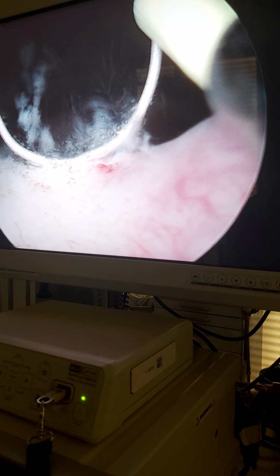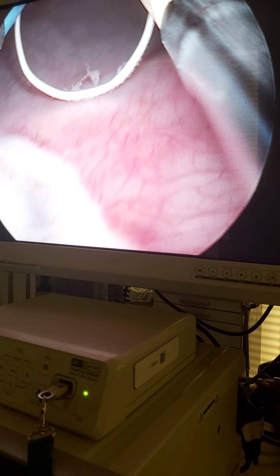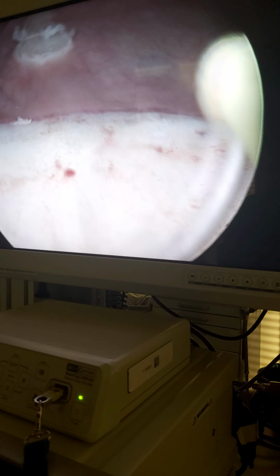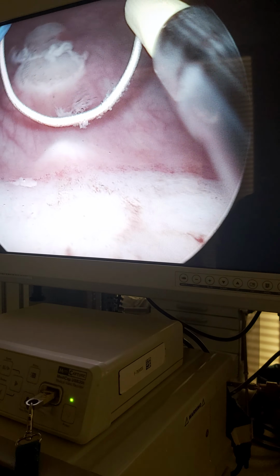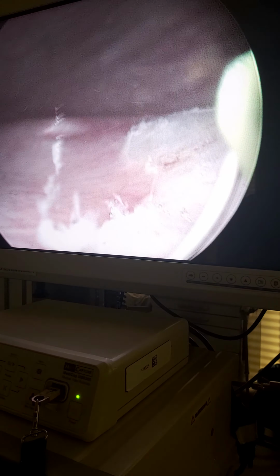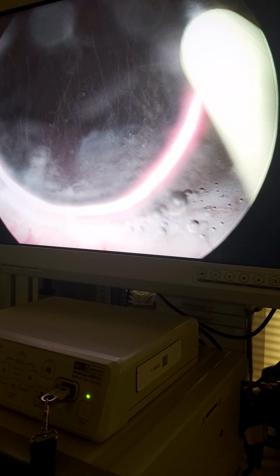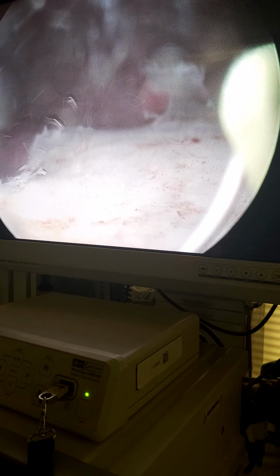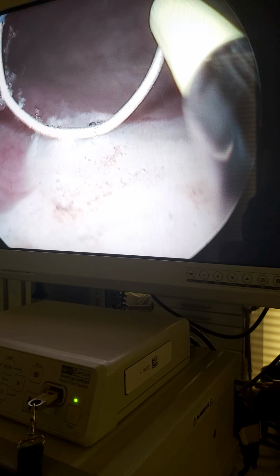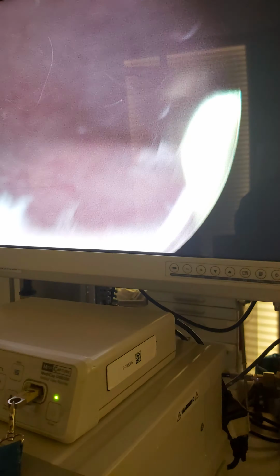Quite superficial in this lady. She has had the disease from her childhood ages, but I think she didn't have too much and too bad flares. At least she says baking soda was enough for her for a long time to cure her from the flares. And it was a superficial leukoplakia. What I see here, but it didn't disappear with lots of medications, so she chose to have this operation to get rid of all the medications completely.